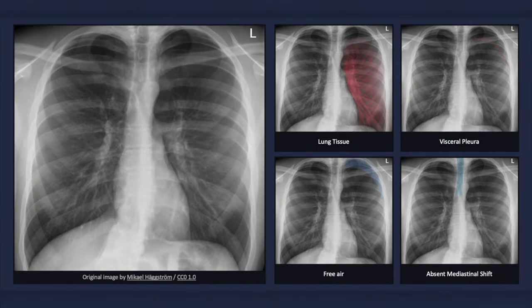With a pneumothorax, a thin sharp white line — the visceral pleura — separates the lung from the free air, which is void of bronchovesicular markings. In the case of a simple pneumothorax, there will not be any signs of mediastinal shift. Although most x-rays are taken in the erect position for detecting a pneumothorax, since air collects superiorly and laterally in that position, not all patients can stand.